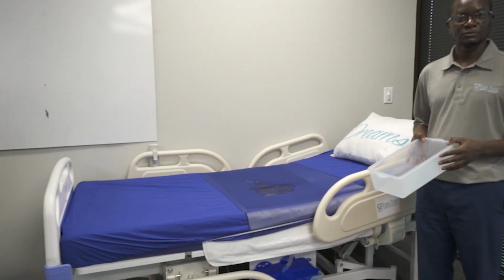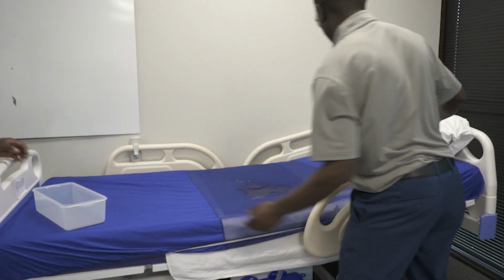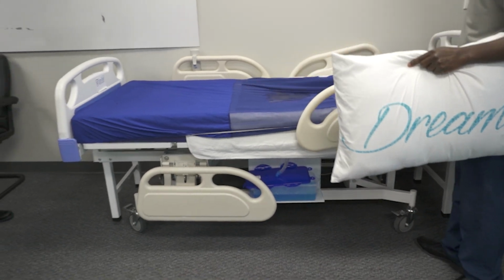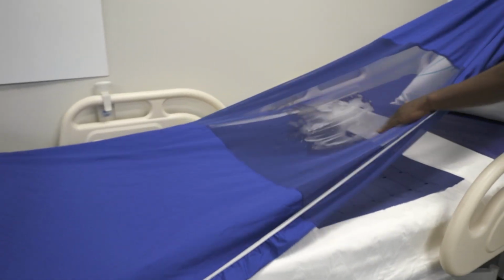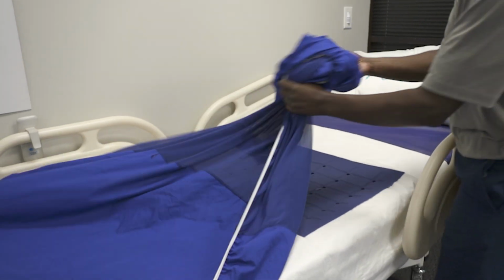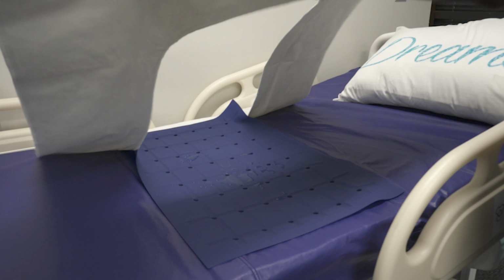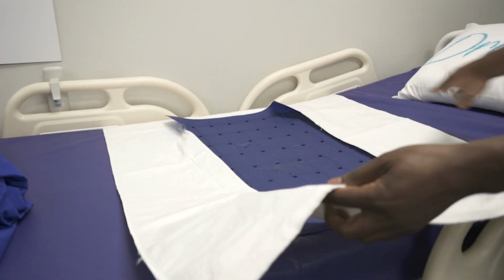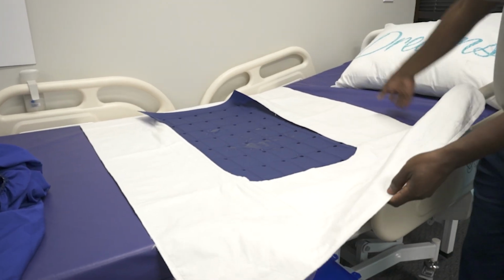Show me a little bit about the inside workings of this bed here. Yes, I will strip the bed so you get to see the concept. We have this special cover, which has a net right here in the middle, which lets the urine go through, and that's special for this bed. And then here we have this. This is a soaker skirt, just in case somebody has too much urine and it runs off the surface. This one will catch it and it doesn't go all over the bed.